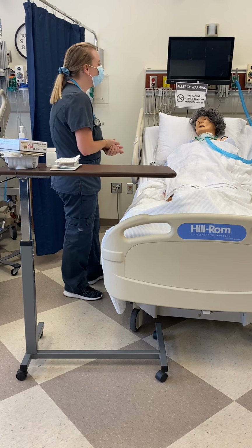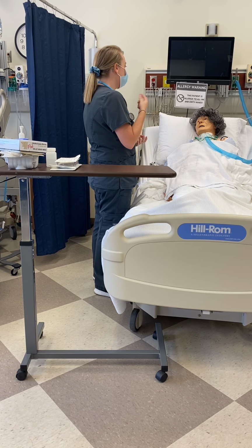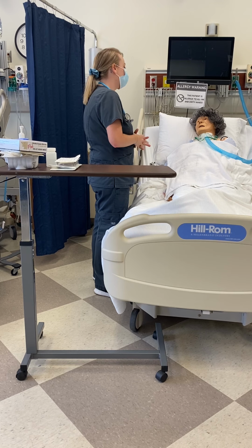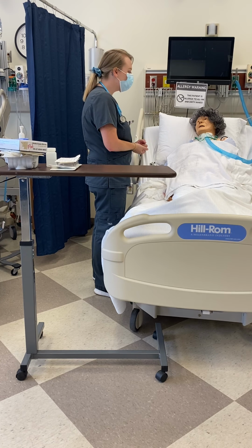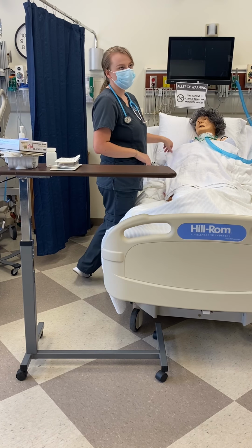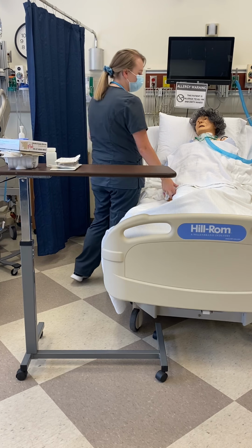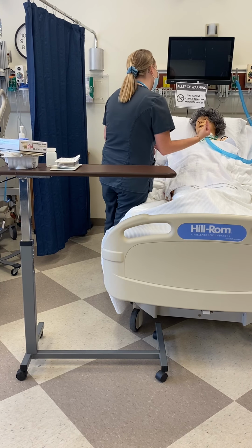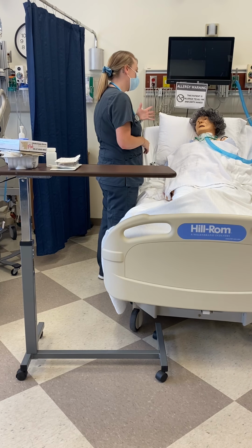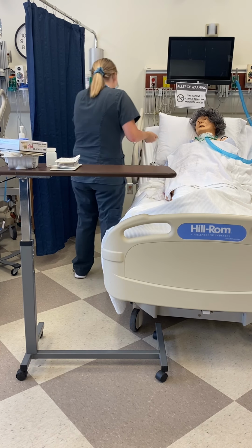I'll explain the procedure to my patient. Hi, we're going to suction out your trach today and clean it. Do you have any questions? No? Okay, thank you. Make sure there is a towel so that if it gets messy, it doesn't get on the gown and the towel catches it. And while I am suctioning, will you please raise your left hand if you are having any difficulty breathing? Thank you.